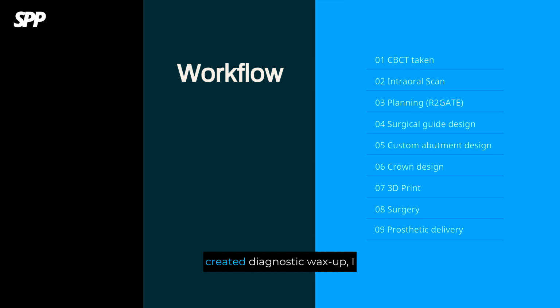Based on the previously created diagnostic wax-up, I designed the provisional crown and the custom abutment. Using a TI base or a stock abutment would also be a good option. I 3D printed the crown and the surgical guide in advance. Immediately after surgery, I delivered the pre-prepared prosthesis. The patient was very satisfied with the result.